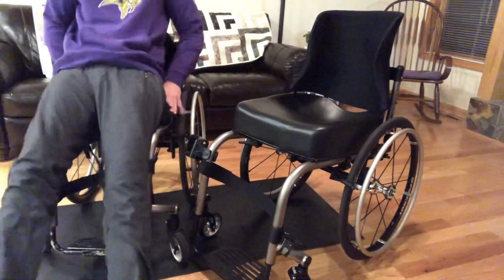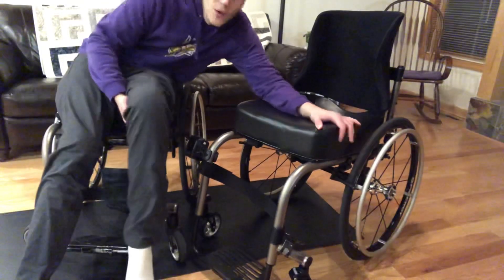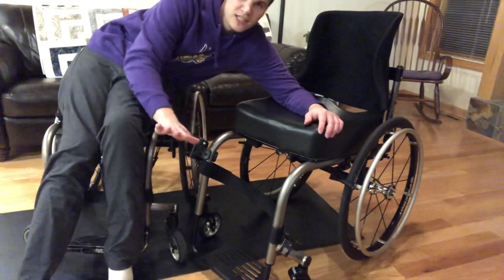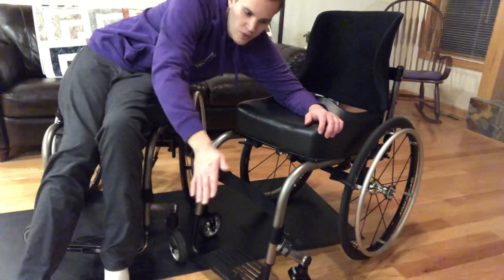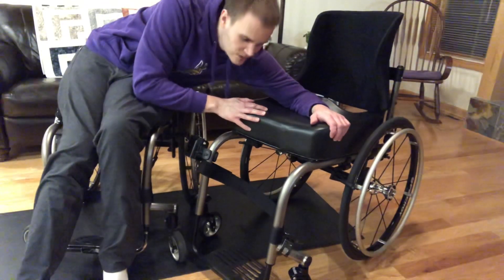My foot got stuck and my shoe fell off, but you can see that was a piece of cake compared to this one. This one I really have to lean forward but I also don't have much hand grip to go forward. So I'm going to have to brainstorm with this one on how to do a floor transfer.